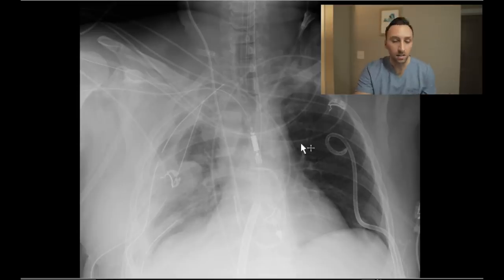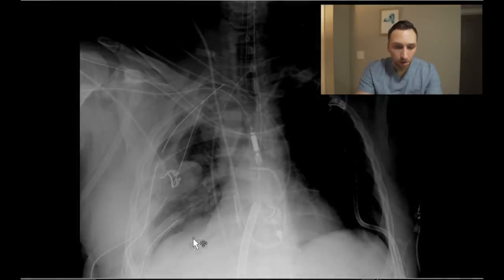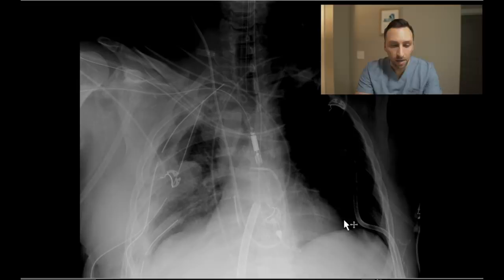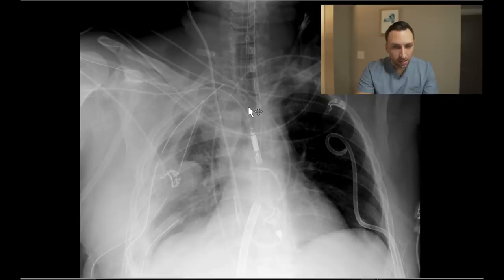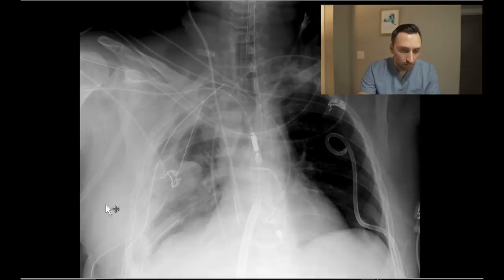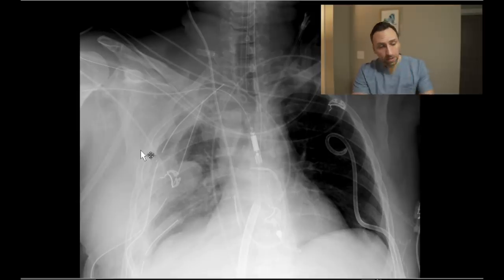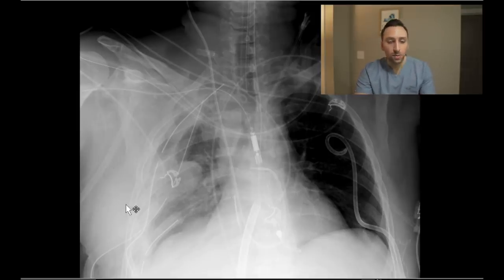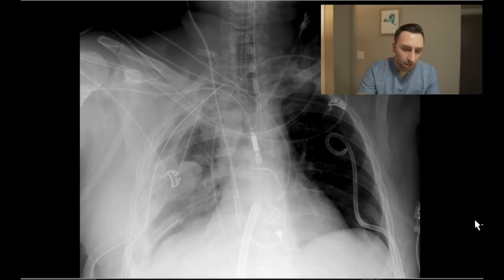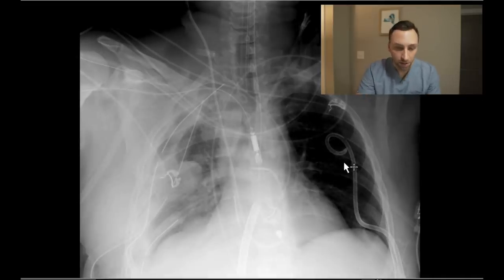Once the lines, tubes, and lungs are out of the way, the next thing I do is look at the mediastinum — making sure there's no pericardial effusion, obvious enlargement of the cardiac silhouette, pneumomediastinum, or pneumopericardium. Then I look at the bones and soft tissues. I glance around the chest wall and neck — you'll be able to see soft tissue gas tracking along the chest wall if one of the chest tubes is malpositioned. I want to make sure there's no obvious osseous abnormality. In this patient, the soft tissues and bones look good.